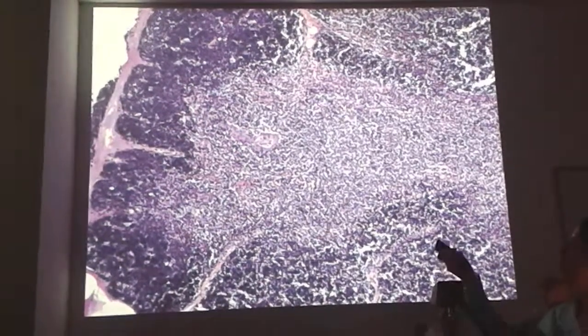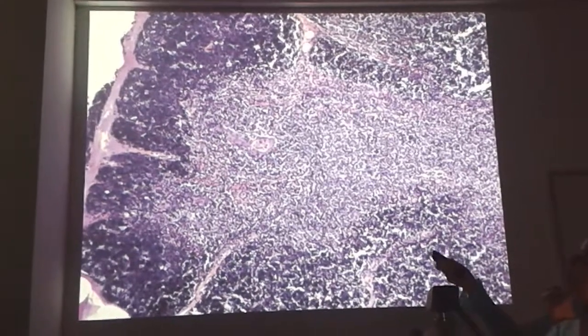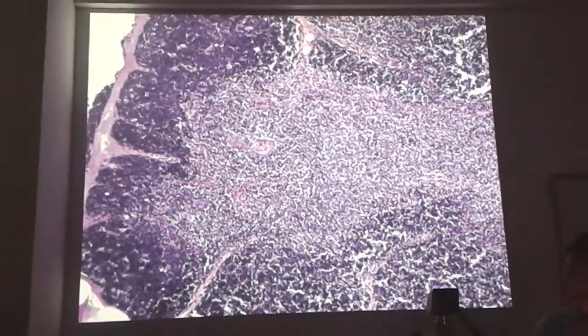And as a feature of the thymus, I'm showing you the Hassall's corpuscle. You know this from your theoretical lectures. Let me try to show you. So I'm in the medullary region of the thymus, the lightest area. In this area, you will see macrophages, dendritic cells, epithelial cells, but also T lymphocytes. But the number of T lymphocytes in the medullary region is much lower than in the cortex.